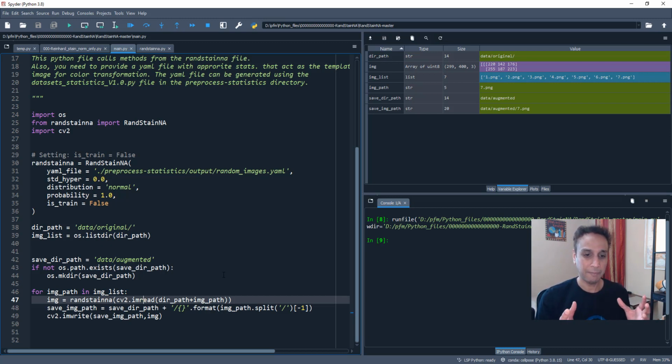focus on the task that you're trying to do. Is your task identifying and segmenting trees and buildings, segmenting nuclei? If so, U-Net does an amazing job. Then what type of data do you have? Focus on collecting the right data. Focus on the right pre-processing steps and right augmentation steps. I think better data definitely beats better models, whatever better is. So unless there is anything disruptive when it comes to image segmentation or object segmentation, I'm going to rely on Mask R-CNN and StarDist and Cellpose and some of these standard techniques.